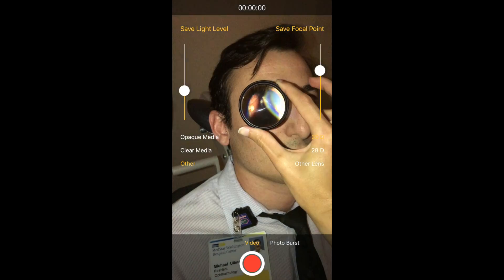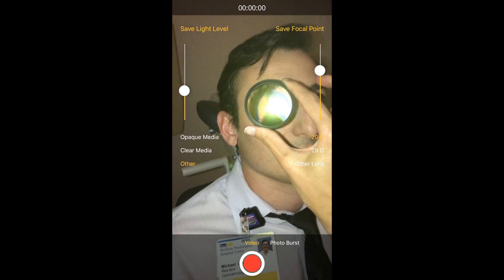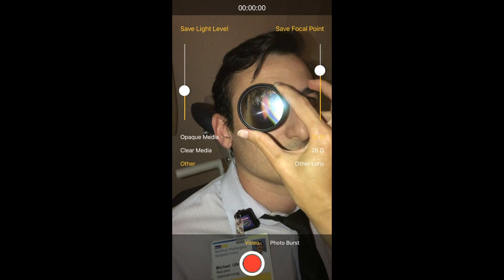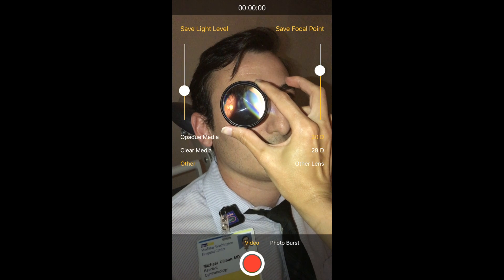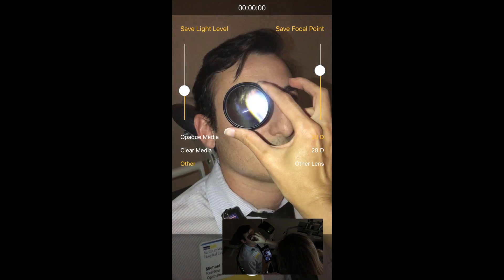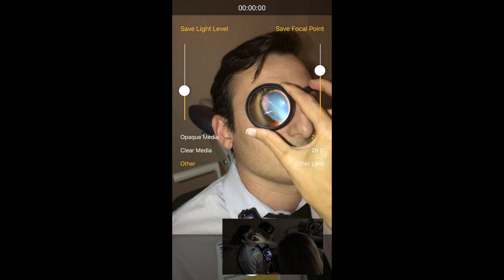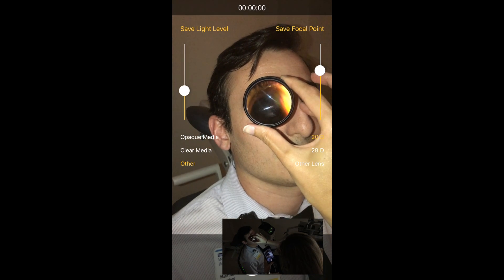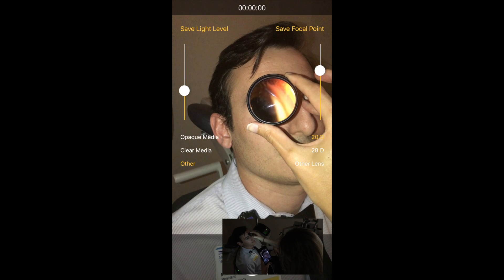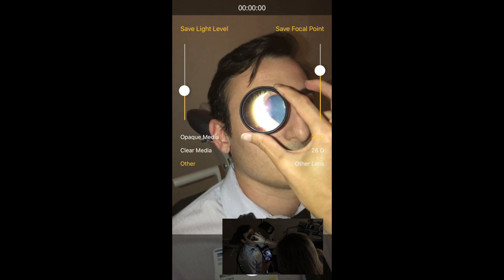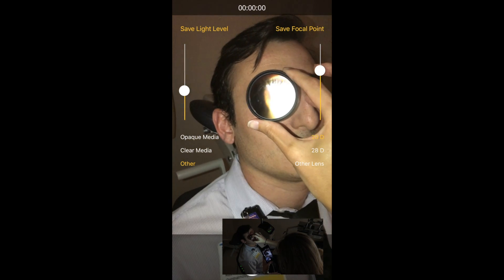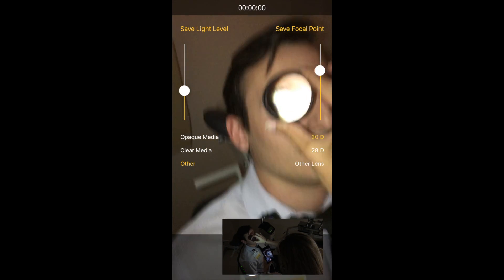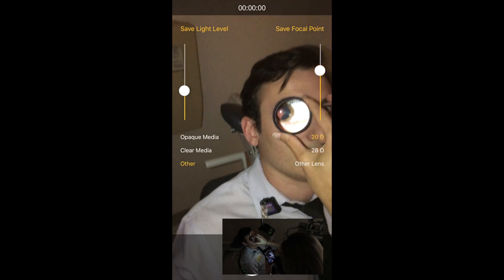Then you basically want to do the exam just like your normal indirect exams. The video inset in the bottom right is just showing the working distance you want to be using — it's very similar to a regular indirect exam where you're about an arm's length away from the patient.